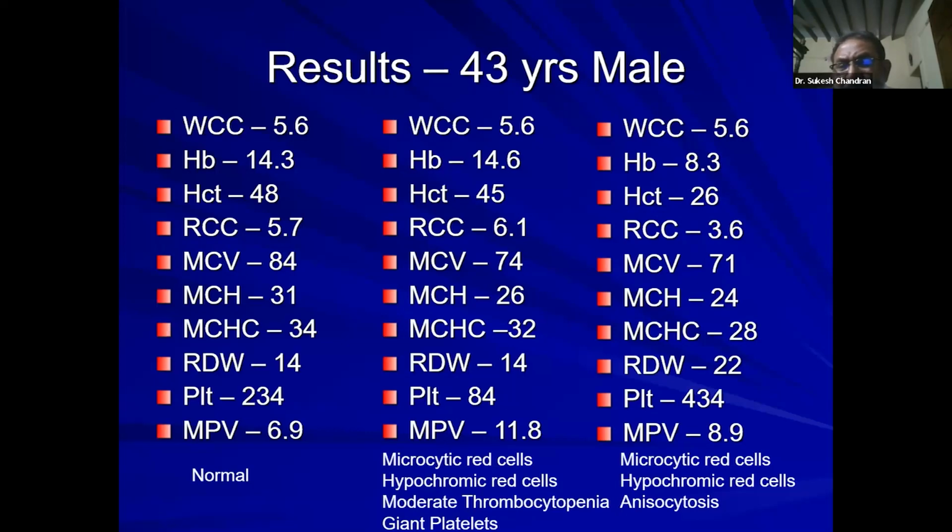Many of the Indian doctors, when they send for investigation, will only ask for hemoglobin. But the cell counter does everything. Some people will ask for hematocrit. Surgeons usually ask for hematocrit. But the cell counter does everything.